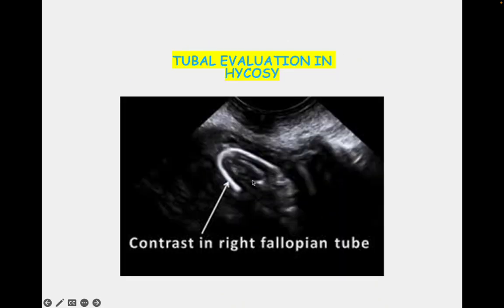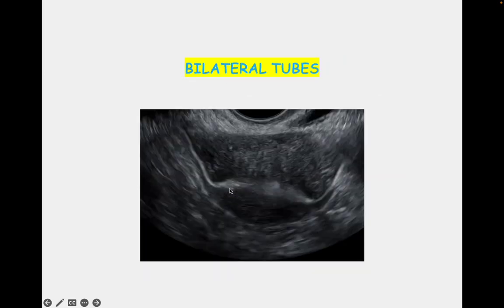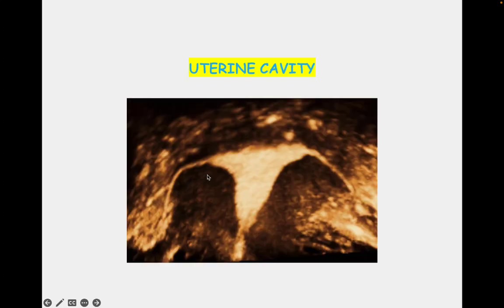This image shows tubal evaluation in HyCoSi, with contrast visible in the right fallopian tube. In another image, bilateral cornua and the fallopian tubes can be seen, as well as a well-delineated uterine cavity.